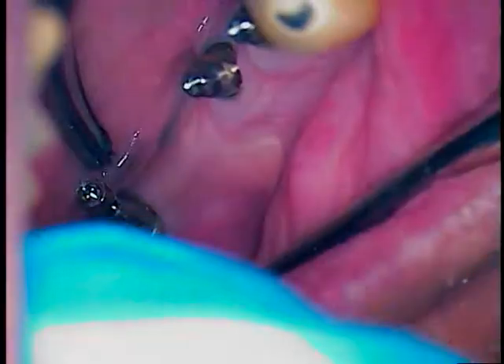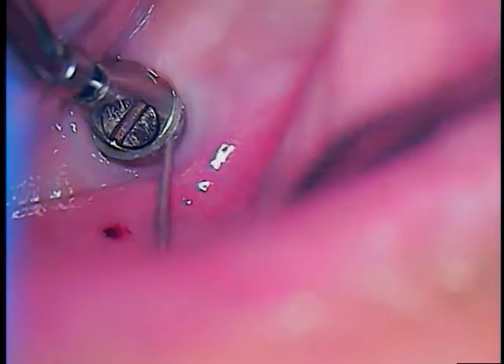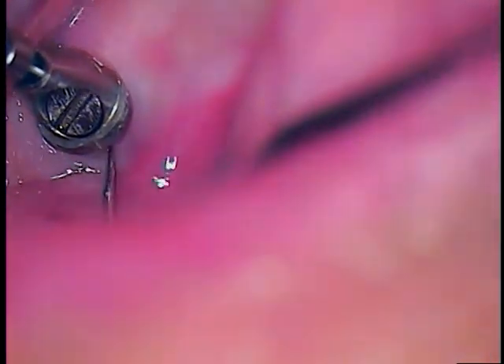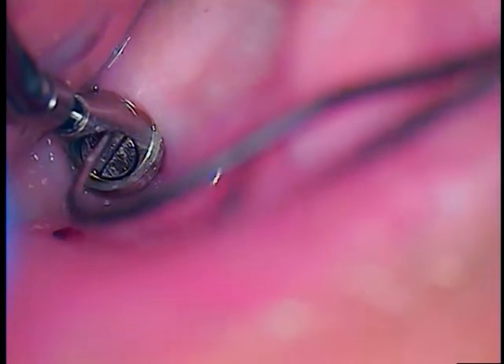I'll just start it with this small driver. So, just bring it up to the next power and hold right there. Before I tighten it, I want to find out if it's bottomed out all the way. You've got to see seam to seam — without a doubt. I think it's a 2mm collar, so I don't feel any seam. I'm feeling down in here — that looks good. You can almost just take the explorer, maybe spin it a little bit, try to move it. You want to make sure it gets centered, and then just a little hand tightening. That's all we have to do.